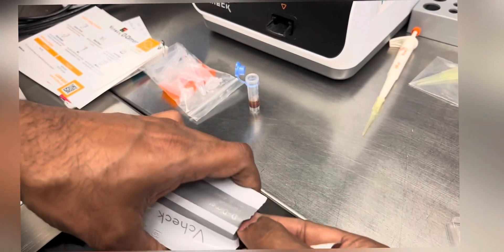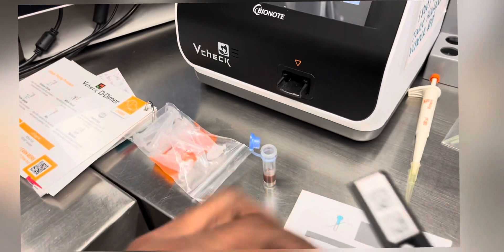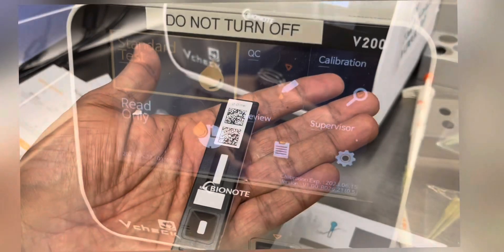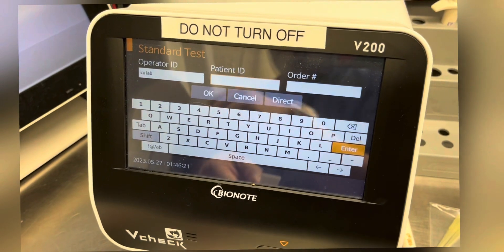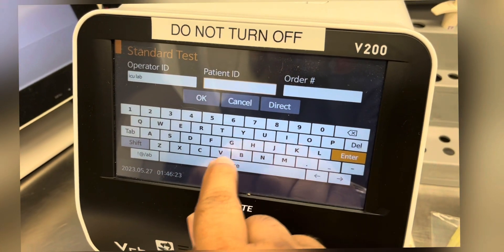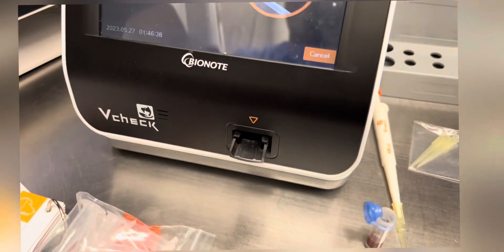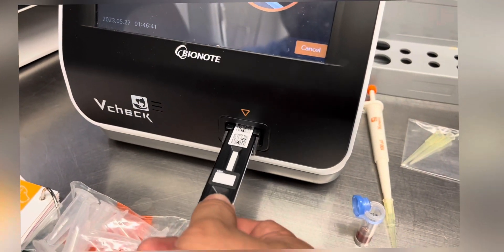The next step is to open the cartridge pouch and make the machine read the barcode of the cartridge. Select the standard test and fill in the required spaces, and then when prompted, insert the cartridge into the device.